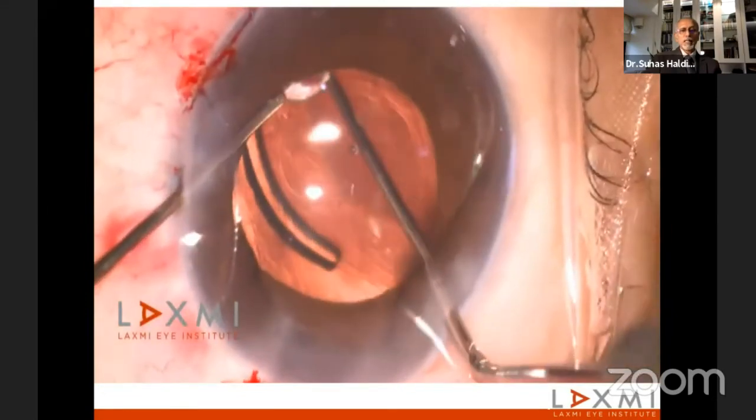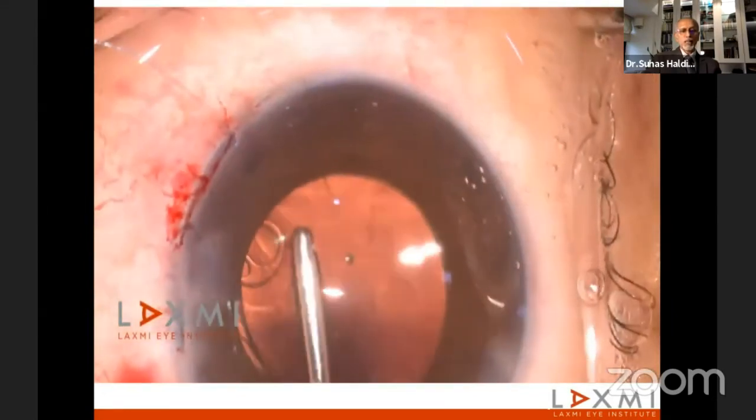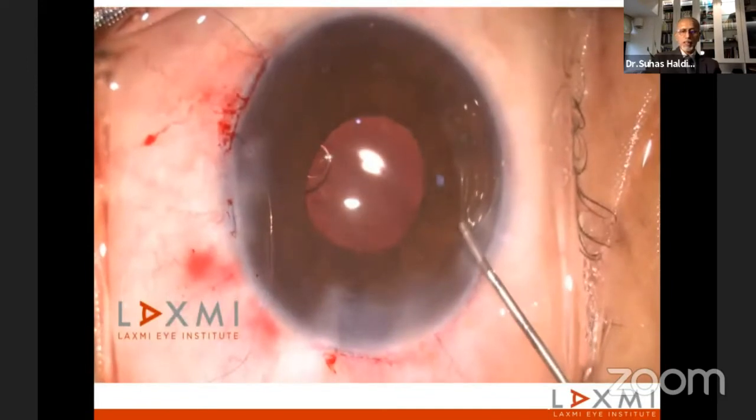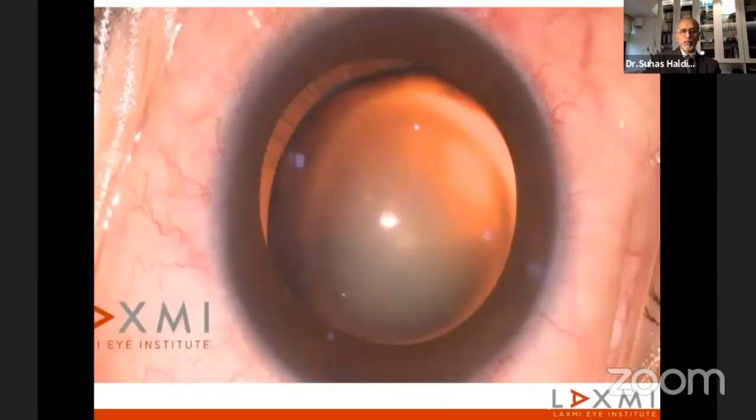And once the lens is in and the viscoelastic is washed out, the suture in the Hoffman's pocket is tied, and the lens is well centered and the pupil is constricted.